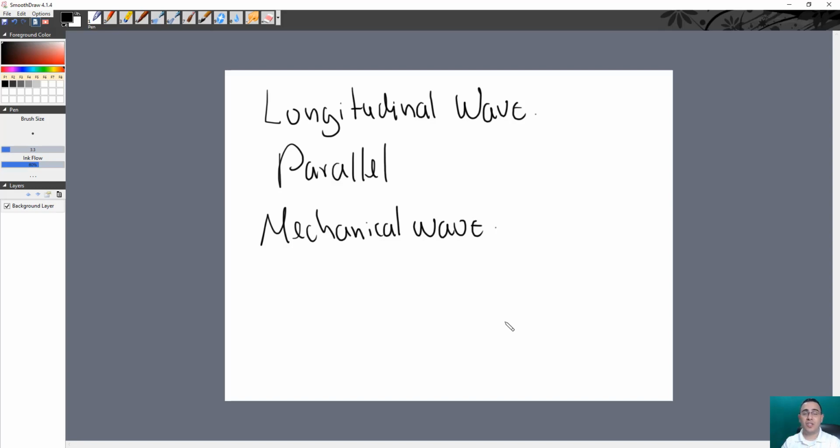And in addition to this, we may say that the ultrasound is a pressure wave that moves energy from point A to point B. Perfect. So that's the ultrasound concept.